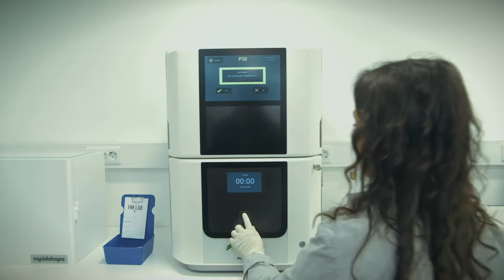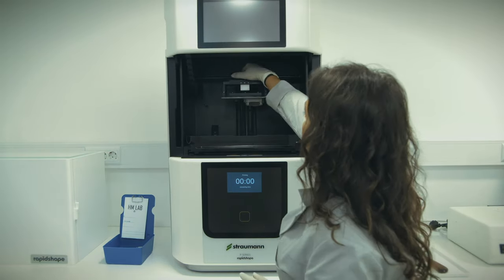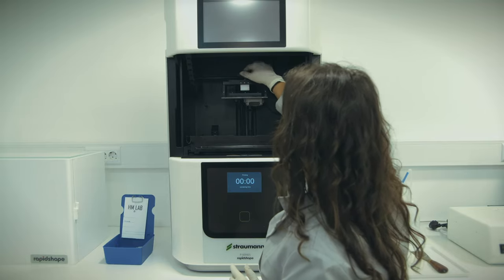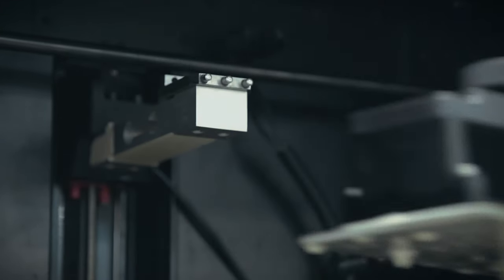If you print many guides, you can position them vertically, while if you print only one guide, you can position it horizontally. It's important to note that the printer needs some room characteristics, such as fresh air supply and protection from UV light.